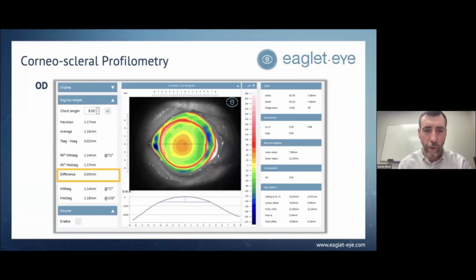That allows for me or any other clinician or staff member to kind of get in there and manually get the eyelids open. You really can't do that very well with many of the corneal topographers, particularly the more preferred corneal topographers with OrthoK, because the space is too close together. It makes it really difficult.